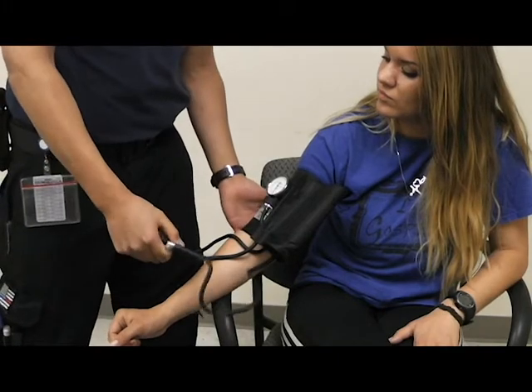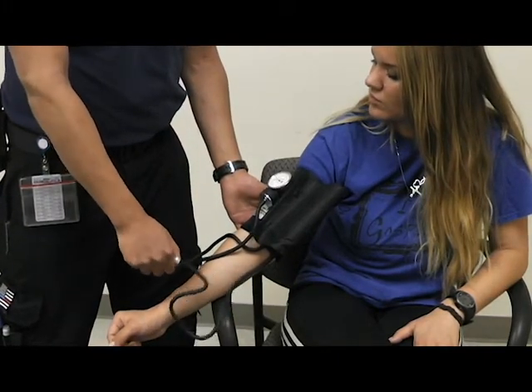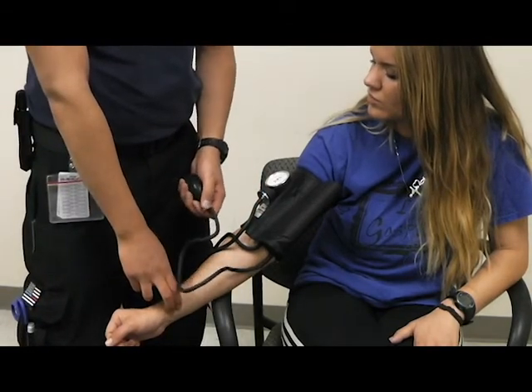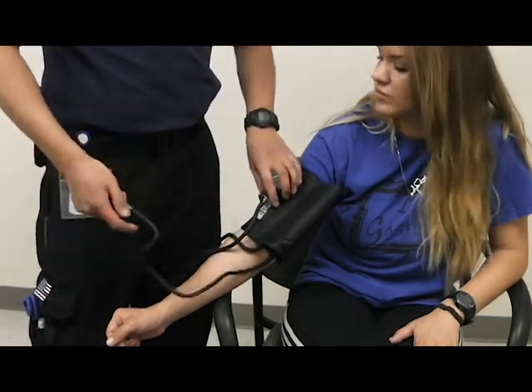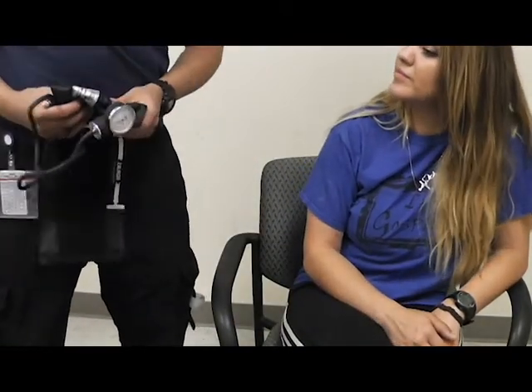Pump up your blood pressure cuff all the way up, then release and feel for the systolic number. In this example, I've got 118. And that is a demonstration on how to do blood pressure.